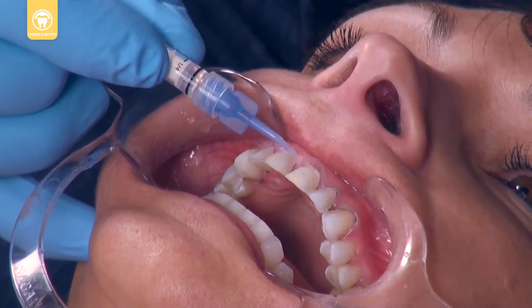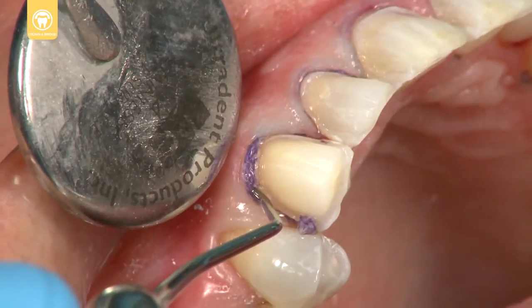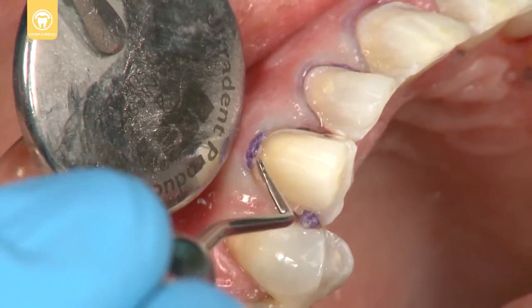Use ViscoStat Clear to control the bleeding and sulcular fluids. Retract the tissue with UltraPack knitted cord. For this case, the double cord technique is used for optimal retraction.